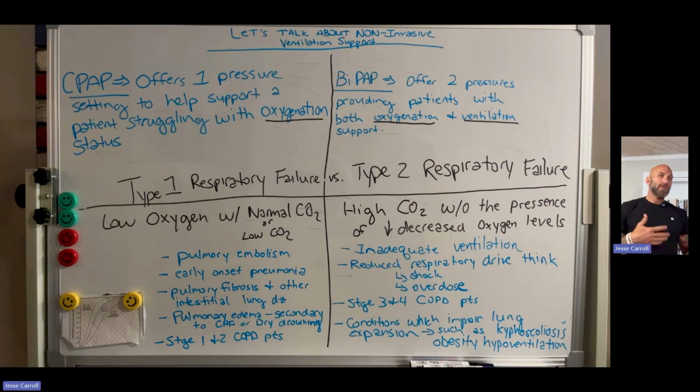But again, usually these pneumatically driven ventilators are also pressure triggered ventilators. And what happens in these BiPAP settings is they usually can't overcome the leak or the actual flow drive and flow desire of the patient to keep up with the patient. And secondarily, they're usually dyssynchronous with the way that the patient actually desires to take their breaths. So what we want to look for is actually utilizing devices that are flow triggered, that can be utilized in CPAP at low or no amounts of FiO2, so 21% room air, and kind of working our way up, or moving into a BiPAP style.